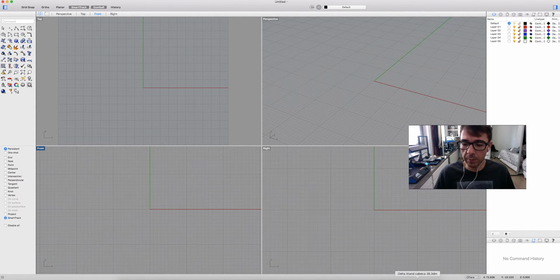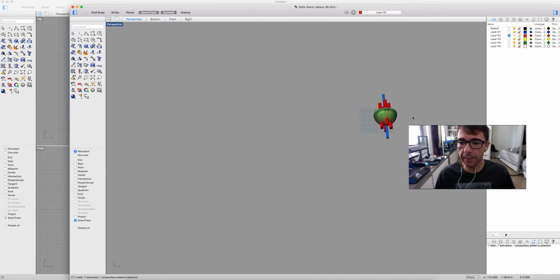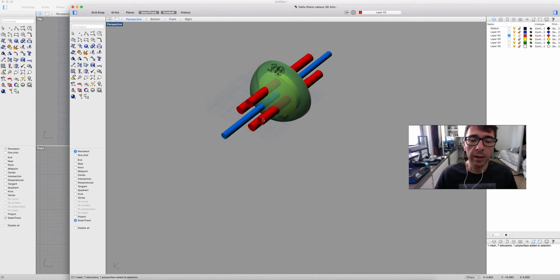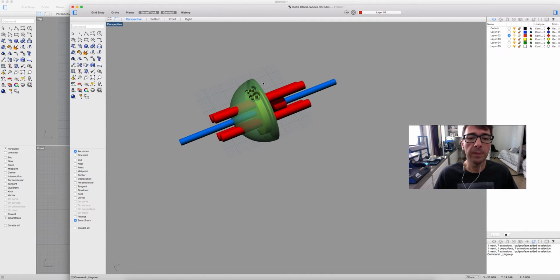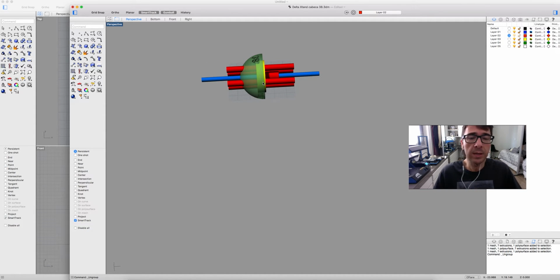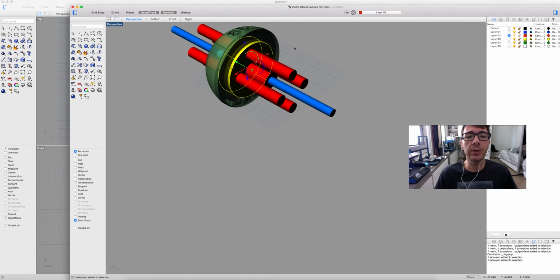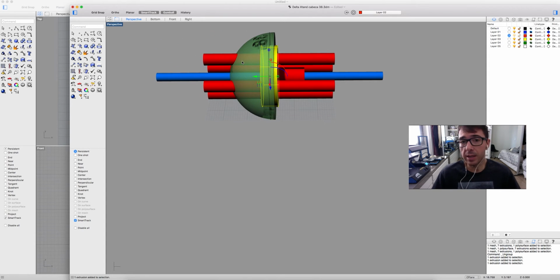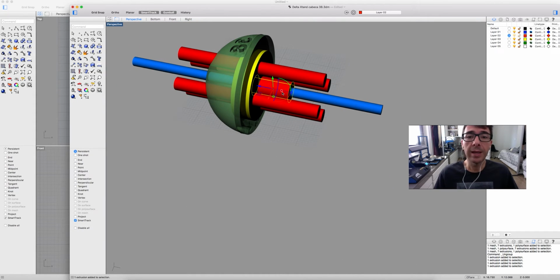Here I have one design that I have already done, and I'm going to show you right there. So here we have in green the glenosphere. It's a 38 glenosphere in green. This is very simple. This is a half sphere. In yellow we have the base plate, as you can see here. It's a cut cylinder. This big yellow cylinder is the central peg of the glenosphere.